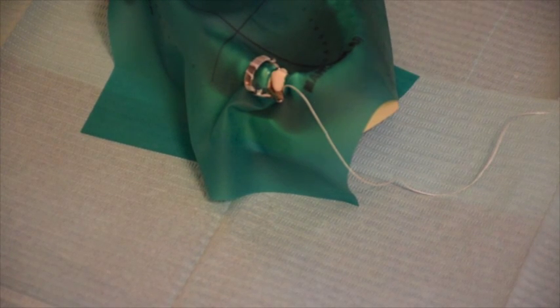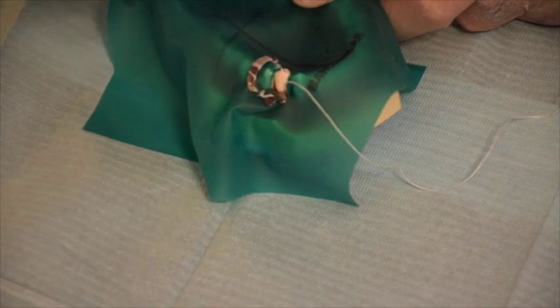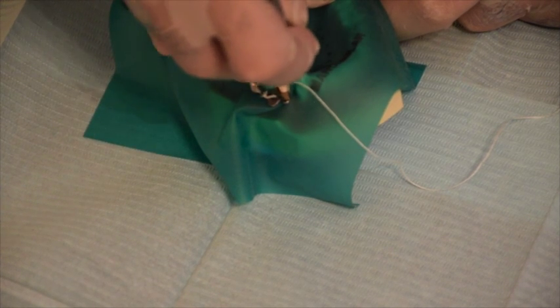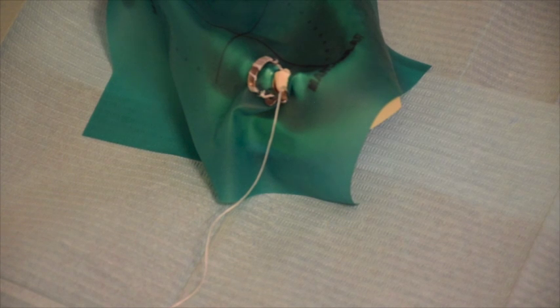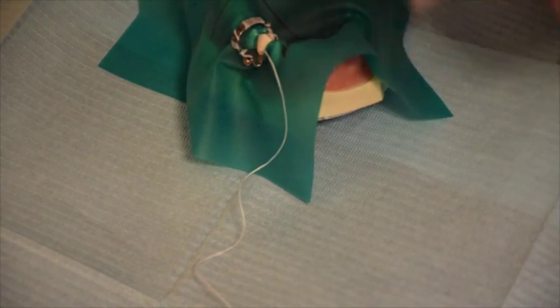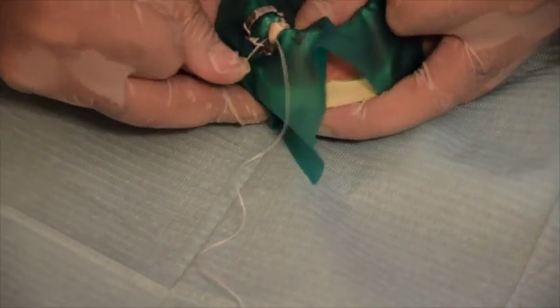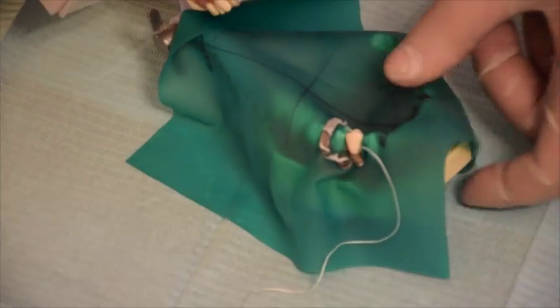Now release the rubber dam off the wings using the plastic instrument — first from the buccal side, then from the lingual side. The rubber dam slides and touches the tooth all around. Then use another piece of floss and pass it through the mesial and distal surfaces to make sure the rubber dam is pushed down to the gum. Note that the dental floss should be on the buccal side.